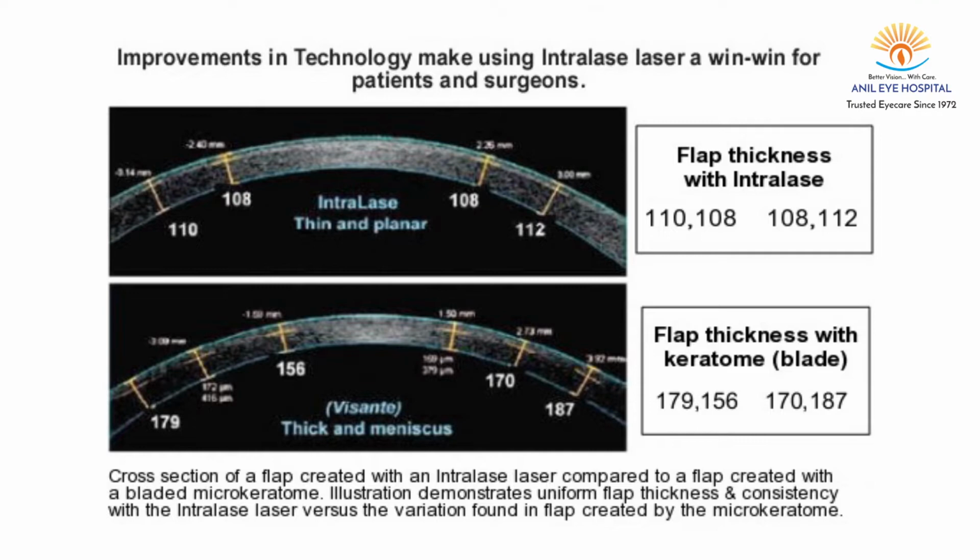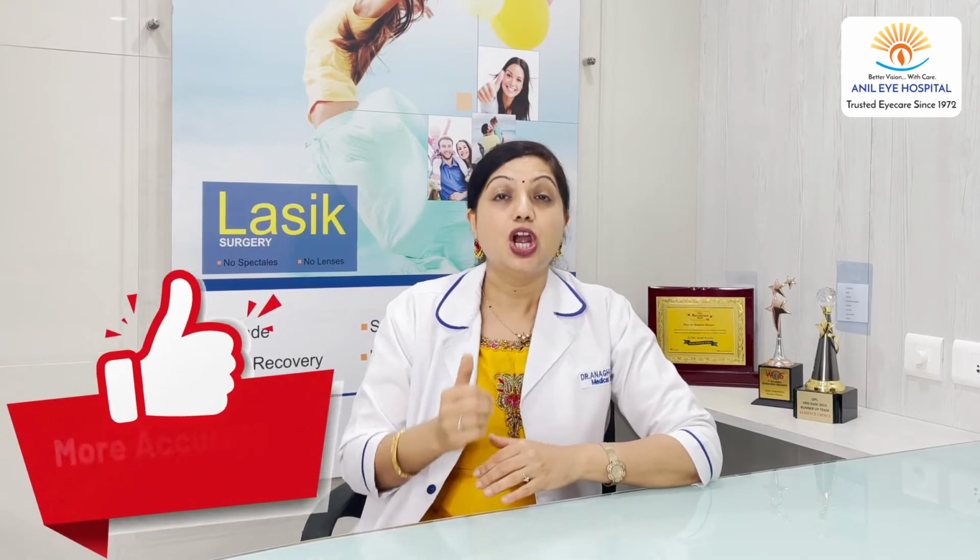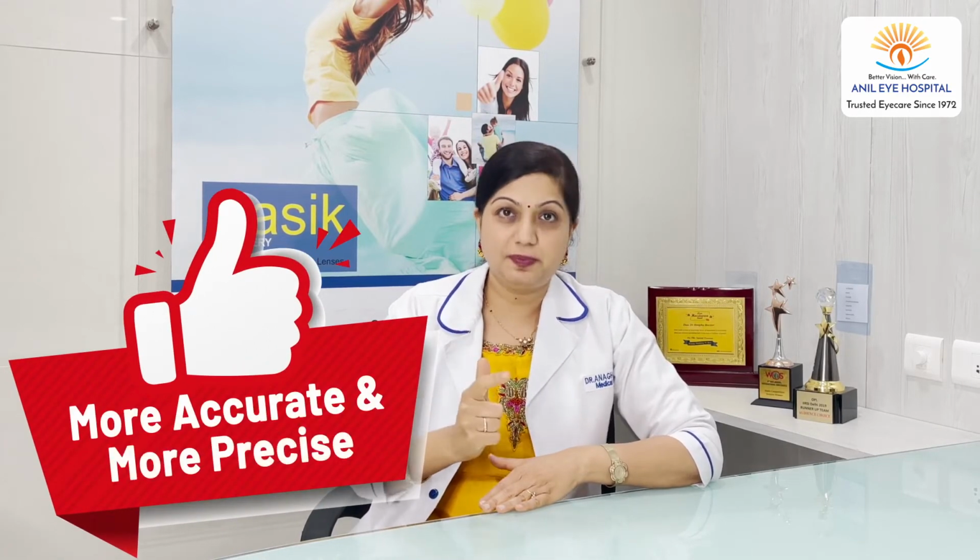Whereas if you look at the bladeless procedure, the flap is equal in thickness in all the places, in the center as well as in the periphery. And that is why the incidence of flap related irregularities or deformities is very less. So this makes a bladeless procedure more accurate and more precise.